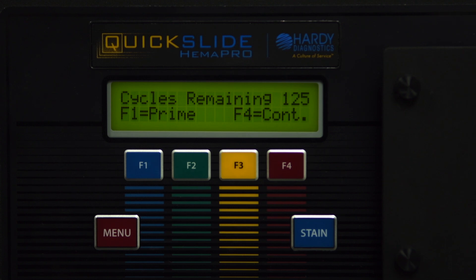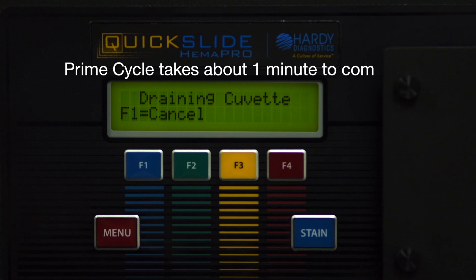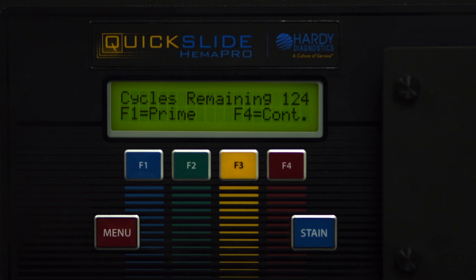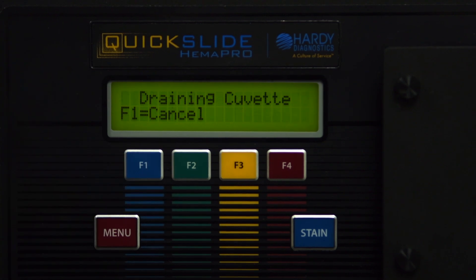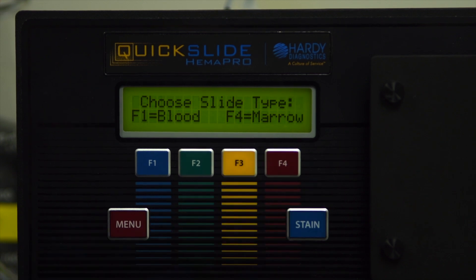The instrument must be primed twice before any slide staining can begin. Press F1 to allow the prime cycle to run. Once the first prime is complete, press F1 again to complete the second round of priming.